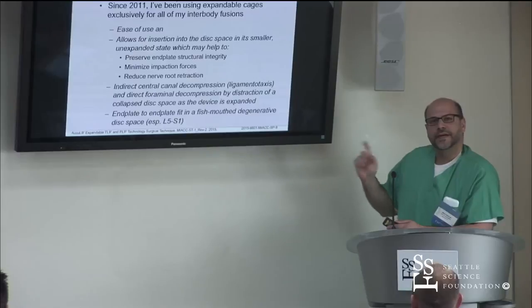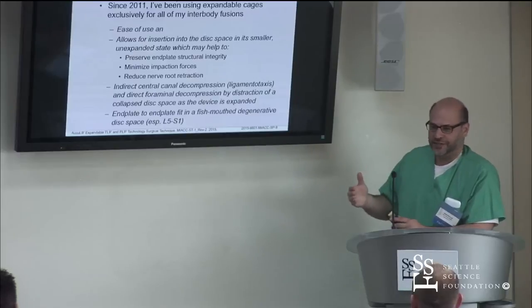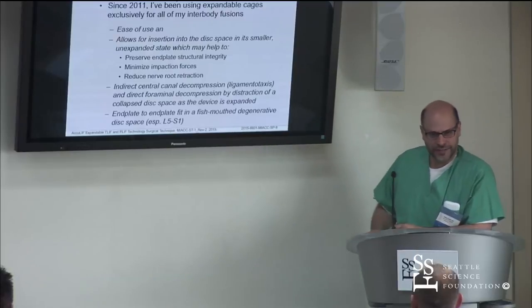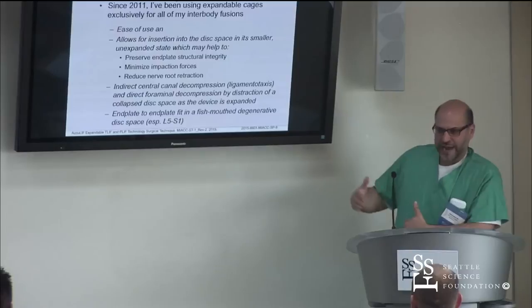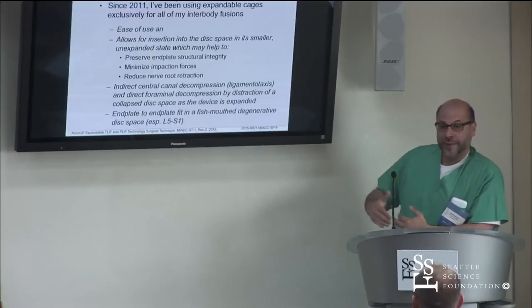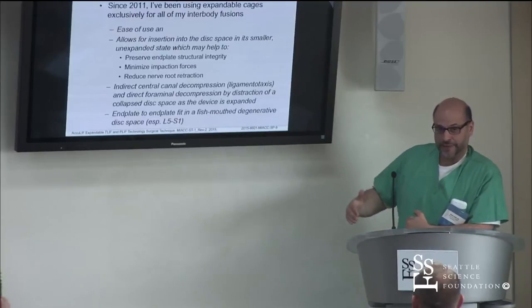Let's see. Yeah, the indirect canal decompression. So it's kind of like the lateral, right? Where they say, you don't have to go and decompress all these central stenoses. Just jack up the interspace and you'll get ligamentotaxis and it'll decompress them. And there's truth to that for sure. It's been proven. Foraminally for sure that happens.